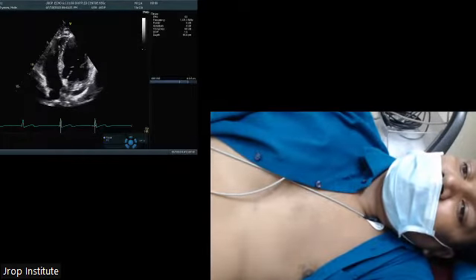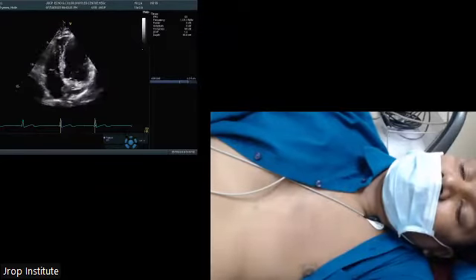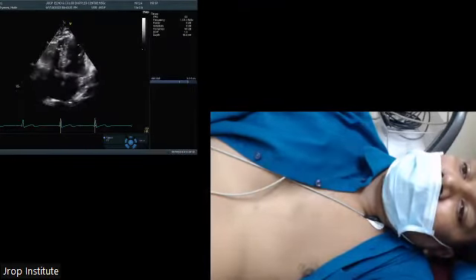Somebody asked me how to store static images. This is static image store. Look at the screen, left side, static image store. If I let it play and store it 2 times, it will be an AVI clip. I hope that is done.